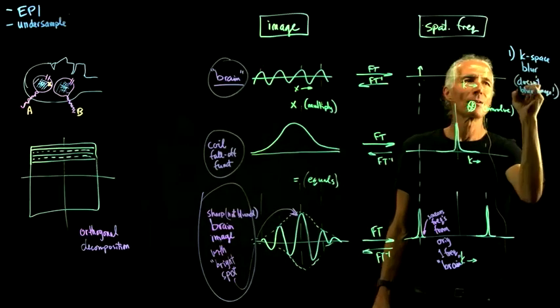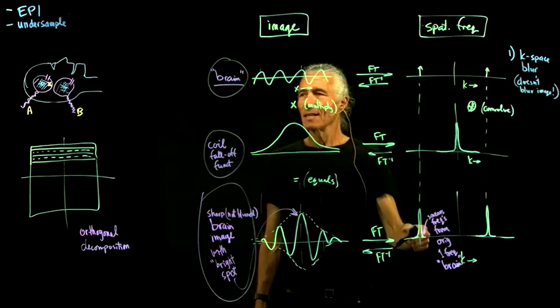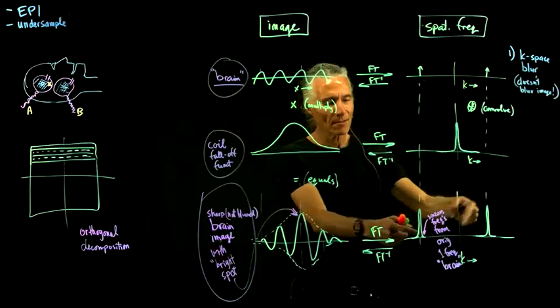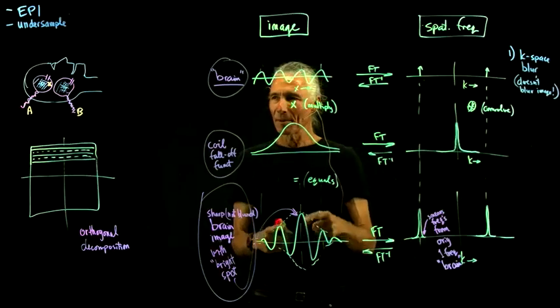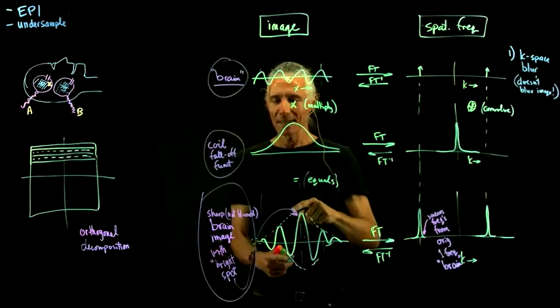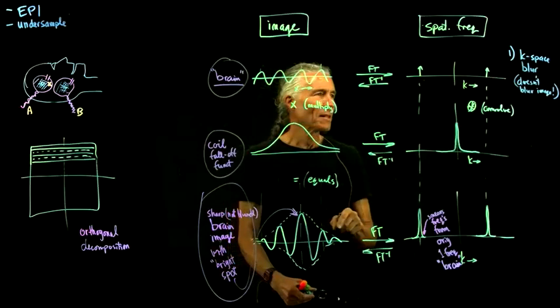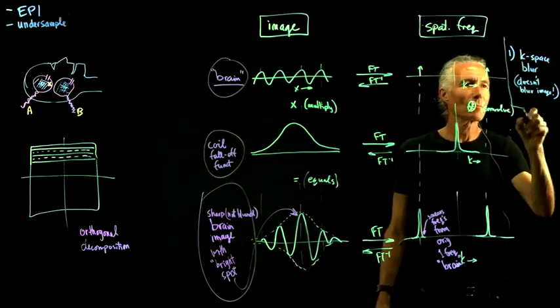It just smears the spatial frequencies into nearby things. When we inverse Fourier transform this, we get something that's sharp, just as sharp as the original cosine. You can see all the bumps in it, but it's got a bright spot. So that's the first important point.